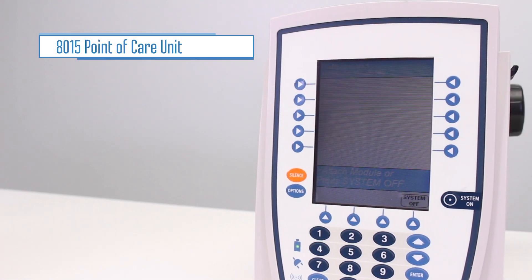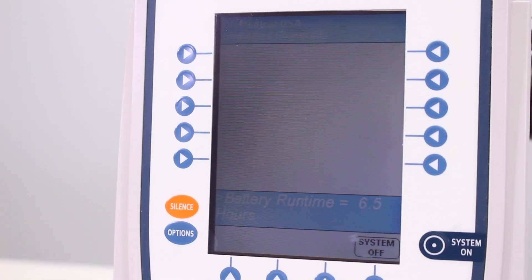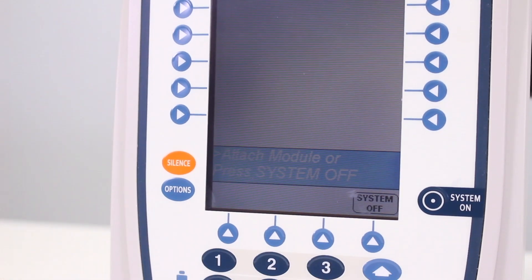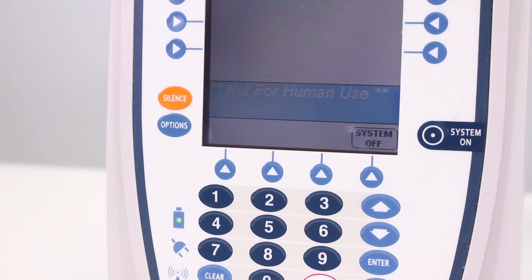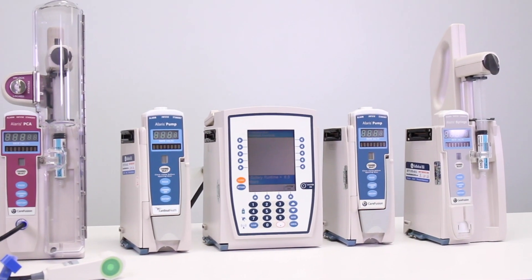The 8015 point of care unit is the brain of the Alaris smart pump system. It contains the educational drug library and is used to program all of the infusion modules. Up to four modules can be attached to the unit depending on the needs of the patient.